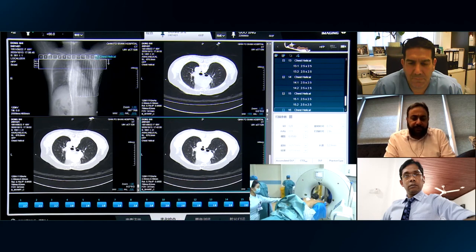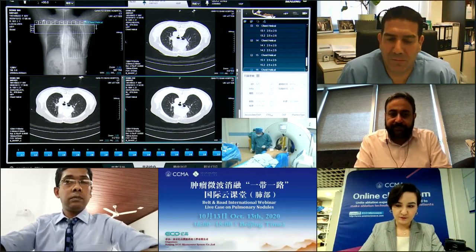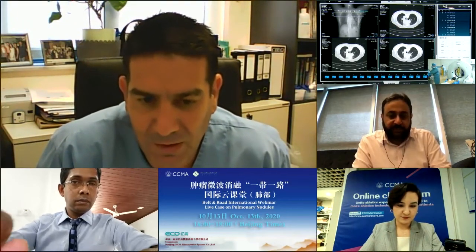Alex, do you use a coaxial system for such ablations? Sorry, can't hear you, dear. Professor Alex, you're mute. We usually do a coaxial biopsy, but for the ablation, we go with one needle directly, like the one you saw here.